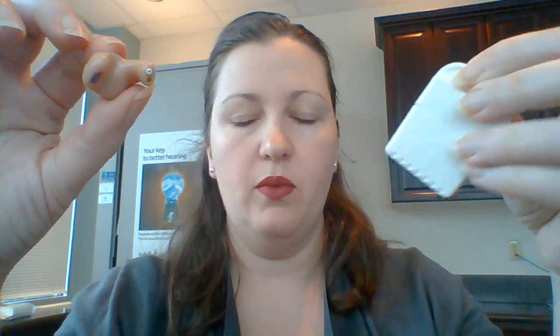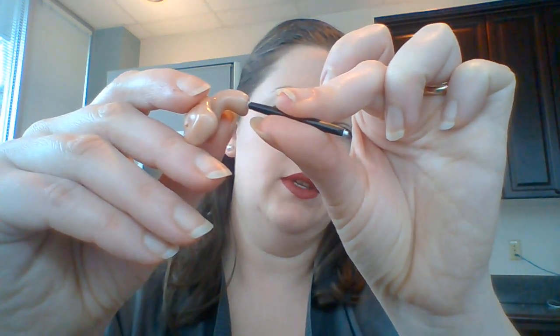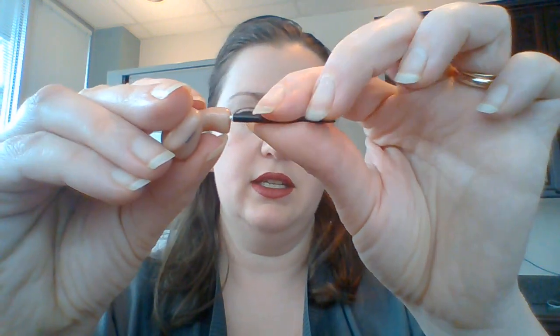With your hearing aid, we will have sent you home with a pack of some sort of wax guards. They have a set of sticks on the inside, and those sticks hold a hook on one side to help you remove a clogged filter and a replacement filter on the other. So you'll line up that hook with the clogged filter and put it straight in and straight out to remove the filter and open up the hearing aid. And then you'll just flip that around, line it up with the same spot, and go straight in, straight out to replace the filter with a fresh one that's ready to go.